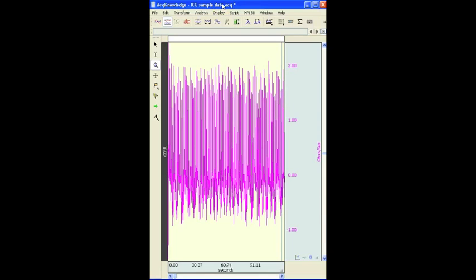The following screencast will provide a demonstration of Acknowledge's Automated Impedance Cardiography DZDT classifier.